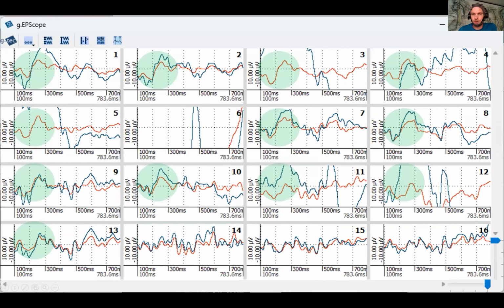So we expected kind of an evoked potential due to the target stimulus, the color image, and all those channels showed that although the original channels really had lots of artifacts on them, we still got very consistent evoked potentials in a scale of several microvolts. So that is the results and live demo of Oscar Live.